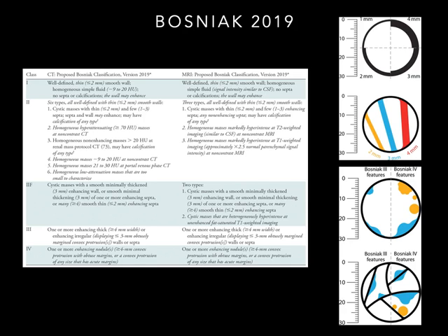What tends to happen with the old Bosniak classification is that it's not very reproducible, is probably the best way of putting it. It's kind of vague descriptions of different kinds of lesions, and you try to characterize your lesion of interest into one of those, whereas there were no concrete measurements you could take.